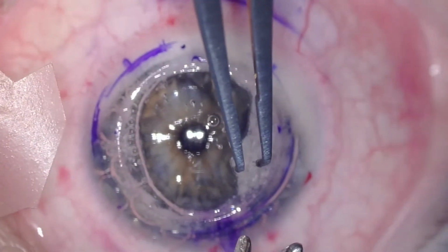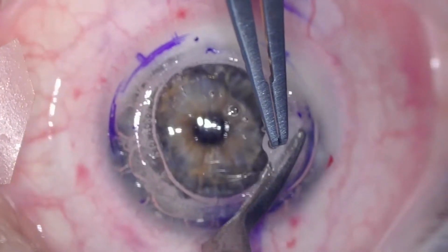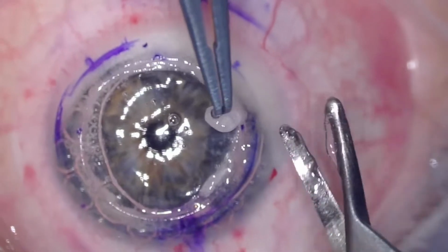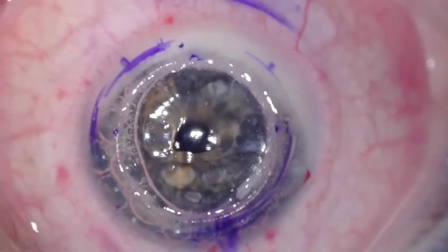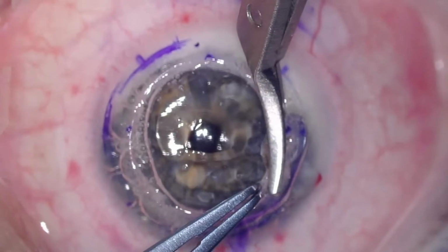Now I'm doing the final quadrant. Now again, be very careful with this final quadrant because the rest of the Descemet's is exposed now. There's nothing securing the superior part of the Descemet's. So this final quadrant is the most challenging part actually. That's why I left a little bit of stroma to trim later on.